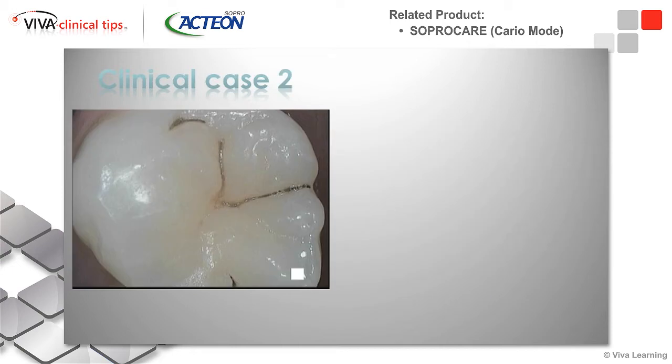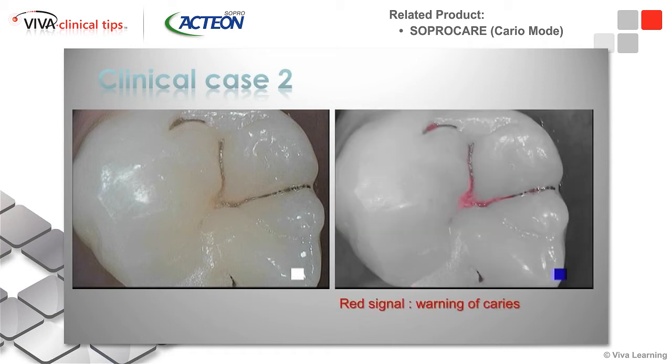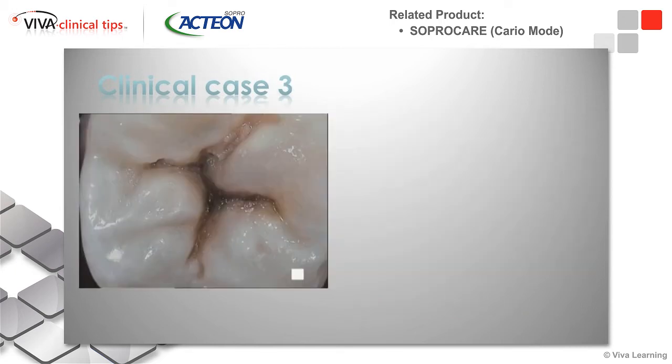Case 2, where we'd normally say, hey, that's just stain, no problem, the Explorer's not penetrating anything, and that would have been the end of that. Well, here we're finding out, as you can see, the red that's going through the stained area.